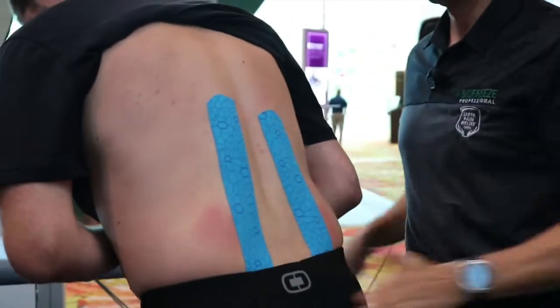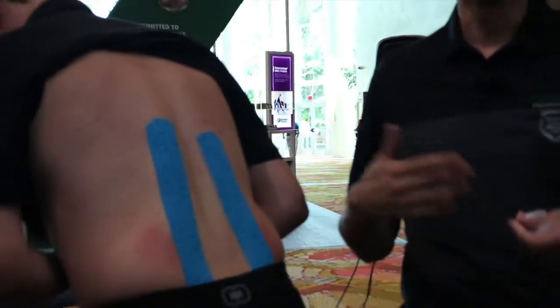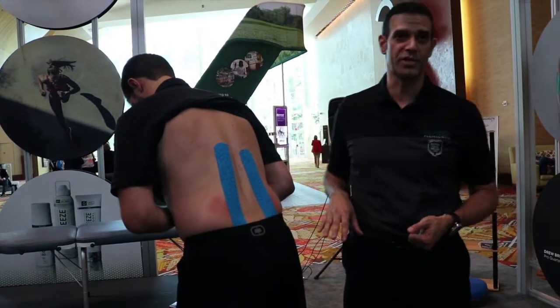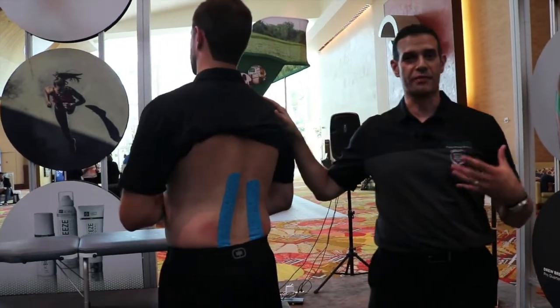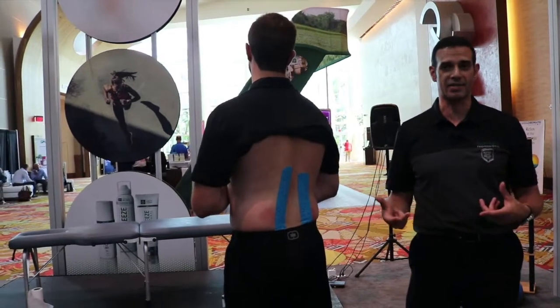And now we basically have a lumbar taping for myofascial pain associated with what would be more of a neurosensory application. In other words, stimulation of the receptors on the skin that were improved during a soft tissue treatment. Now, the other way we can look at this is a little bit more of that mechanical. Granted, it's still a neurologic stimulation, but looking at it more from a mechanical standpoint.